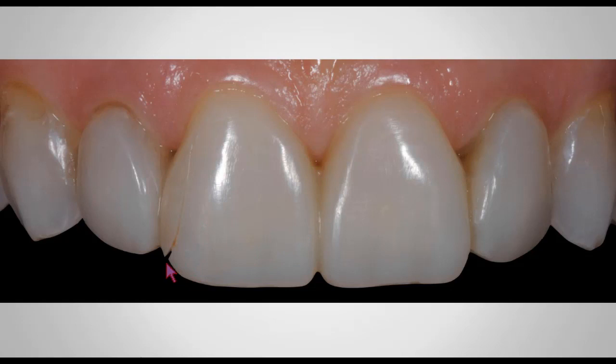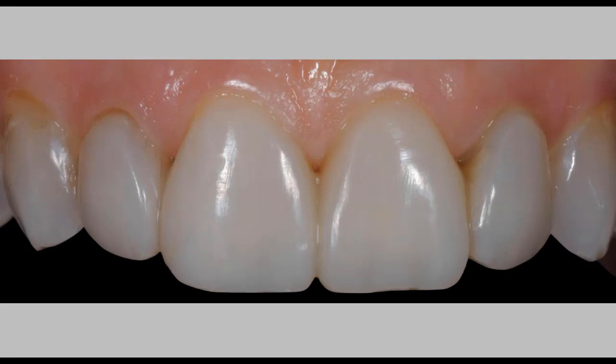So all I have to do when she comes into my office, she called me, I said, come to the office, and this will literally take me a couple of minutes. I use a number 1 or number 2 round bur, cut a little groove in between this fracture line, add a little bit of flowable composite, seat the clear PVS only, without the clear triad, cure through it, and boom, there you go. 20 seconds later, it's been repaired. I polish, I send the patient back home. Obviously, I adjust the occlusion.